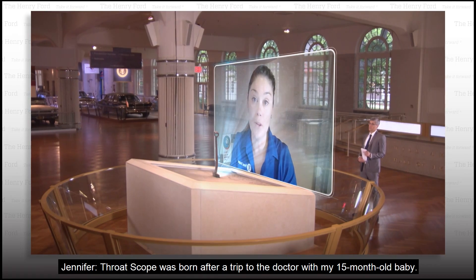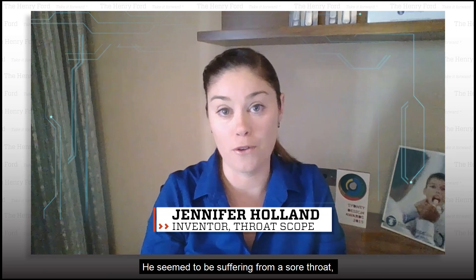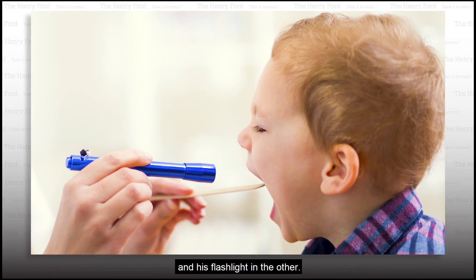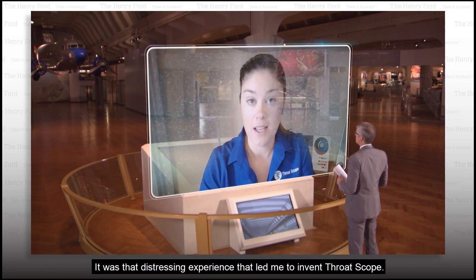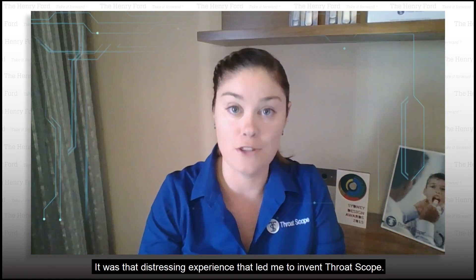Throat Scope was born after a trip to the doctor with my 15-month-old baby. He seemed to be suffering from a sore throat, so the doctor got out his wooden tongue depressor in one hand and his flashlight in the other. He then asked me to restrain my child whilst he pried open his mouth with the wooden tongue depressor. It was that distressing experience that led me to invent Throat Scope.